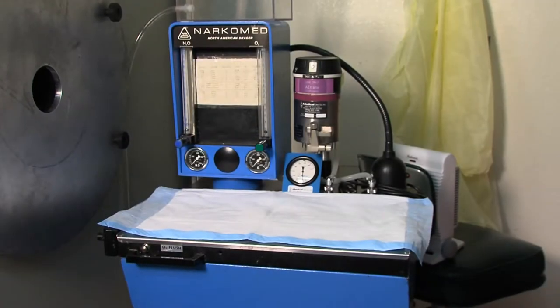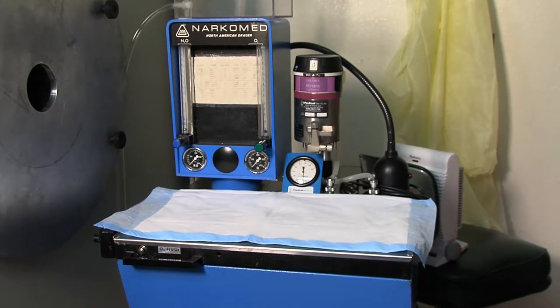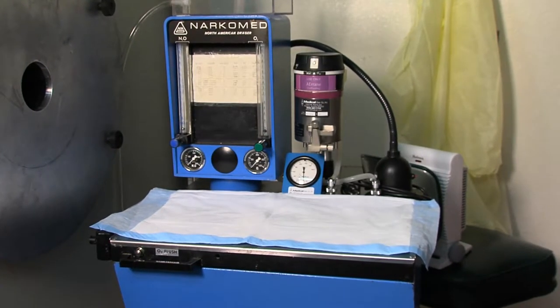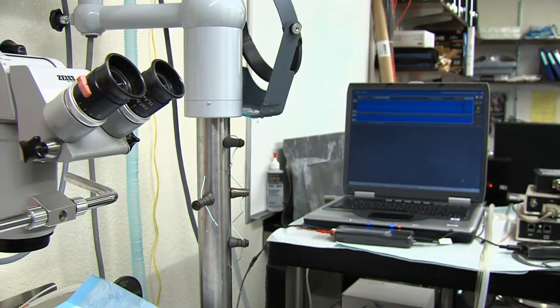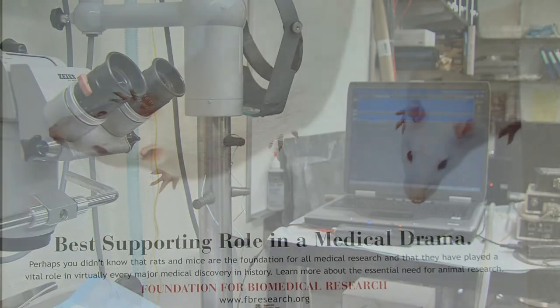All of our small animal imaging occurs under protocols established by CGRI veterinarian Dr. Gail Stevenson. We're fully equipped with state-of-the-art anesthesia systems and animal monitoring instrumentation to ensure animal welfare.